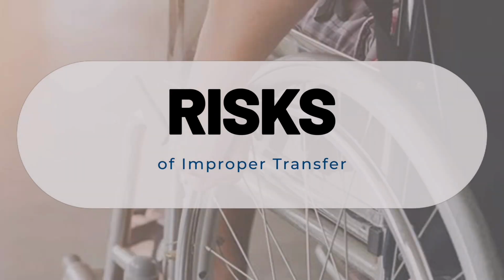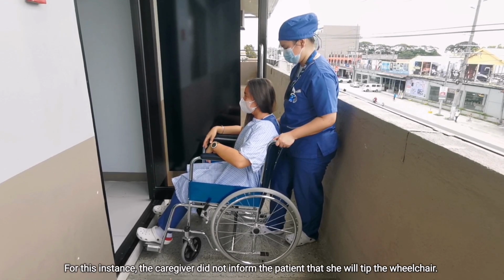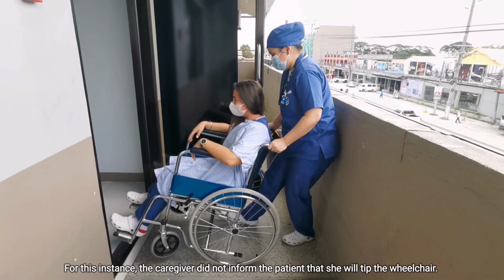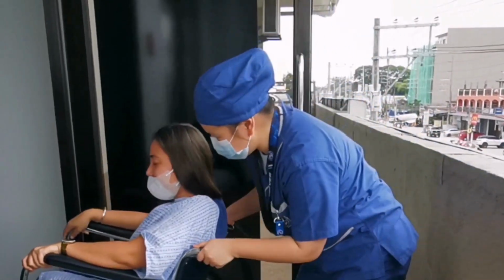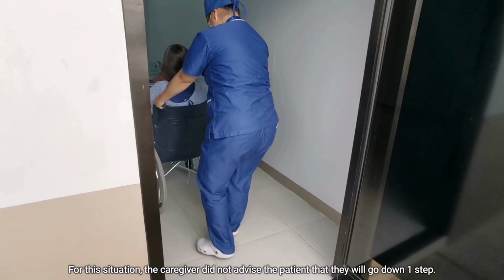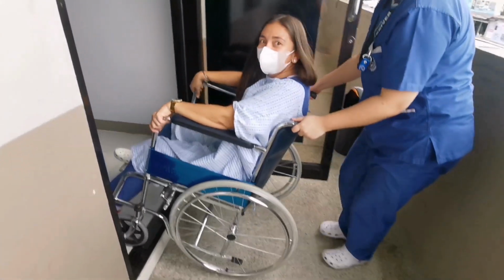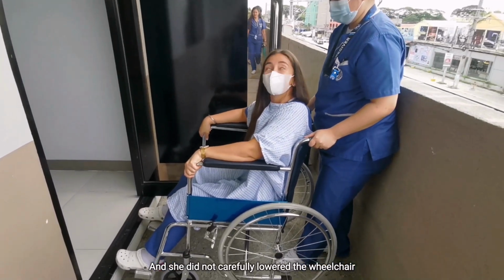Risk of improper transfer. Patient will get shocked or probably mad if you don't inform them of what you will do. For this instance, the caregiver did not inform the patient that she will tip the wheelchair. For this situation, the caregiver did not advise the patient that they will go down one step. And she did not carefully lower the wheelchair.